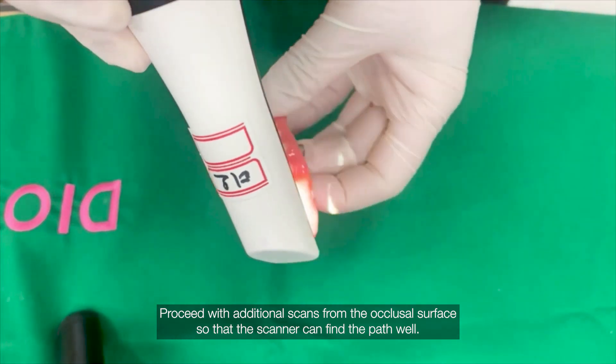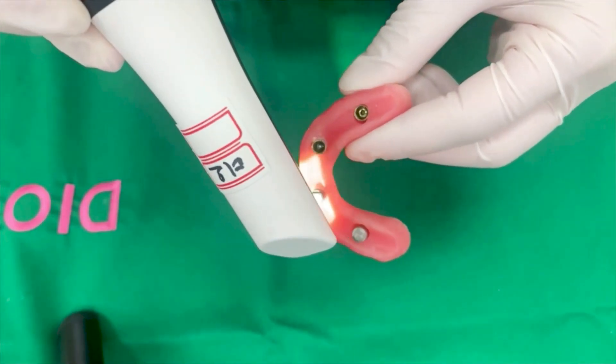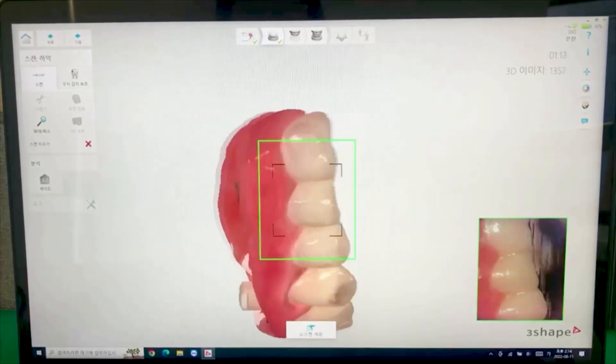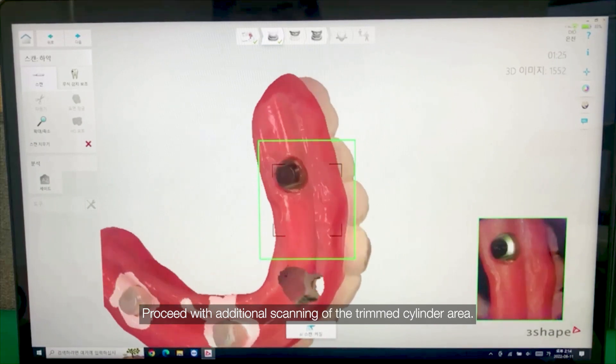Proceed with additional scans from the occlusal surface so that the scanner can find the path well. Then proceed with additional scanning of the trimmed cylinder area.